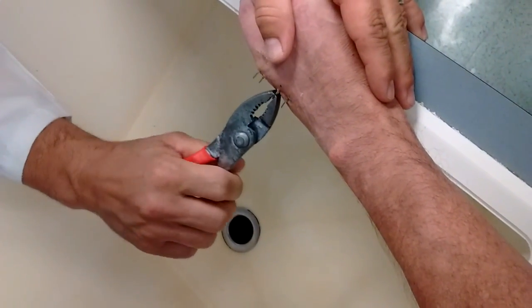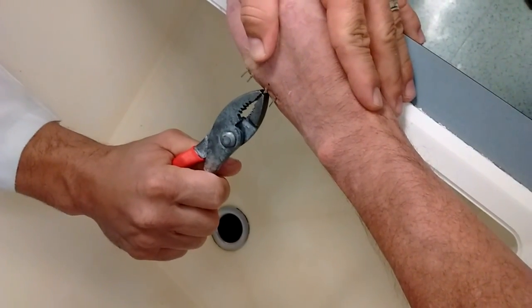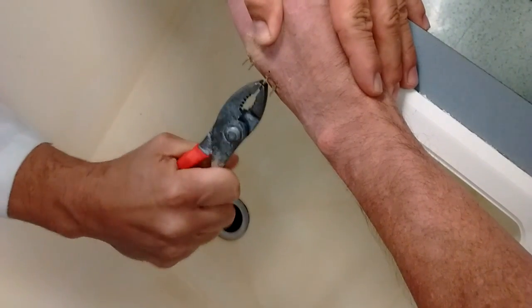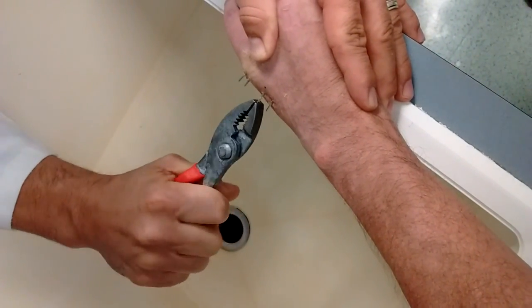I'm going to do the hard one first right here. It might be hard, it might not be. So just grab it, and you just kind of pull gently, and just kind of see how it's coming out? Just slowly, it's a slow process. Just kind of comes right out like that.